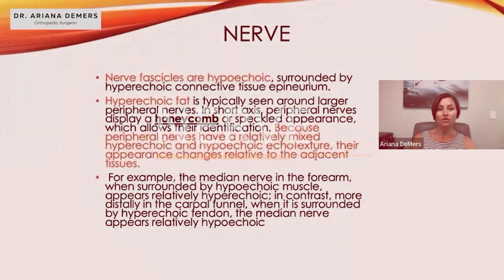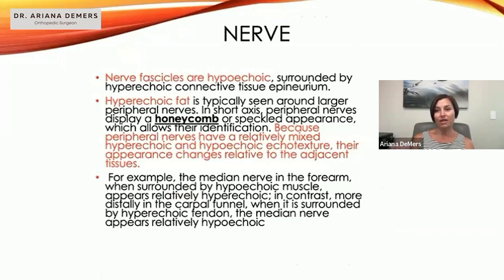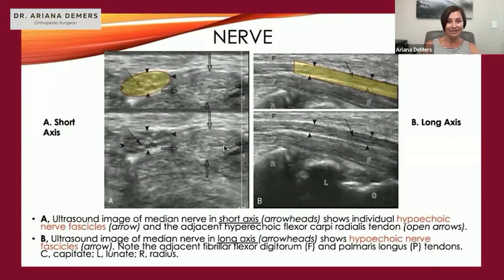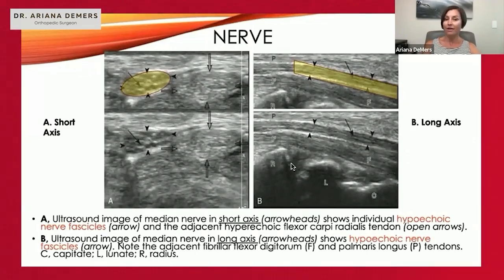Next is nerve. Nerve fascicles are hypoechoic, surrounded by hyperechoic fat, and they display a honeycomb or speckled appearance due to the mixture of hyper- and hypoechoic elements. Here we see the median nerve in short axis or cross-section, and also in long axis — you can see the beautiful honeycombing. Next to it is a tendon, but that honeycomb hypo- and hyperechoic texture is characteristic of the median nerve. Nerves differ from the fibrillar texture of tendons or ligaments, though on long axis view it can be difficult to tell the difference.